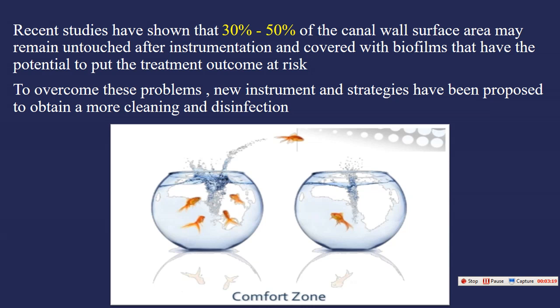of many types of bacteria. So the bacteria become strong and resistant to the treatment. So I need an instrument to scrub it, because it is not removed easily. If there is a single bacterium, it can be removed easily, even with irrigation. But this biofilm, an aggregation of types of bacteria, becomes more resistant to the treatment and needs scrubbing, as it is not removed easily from the canal wall.